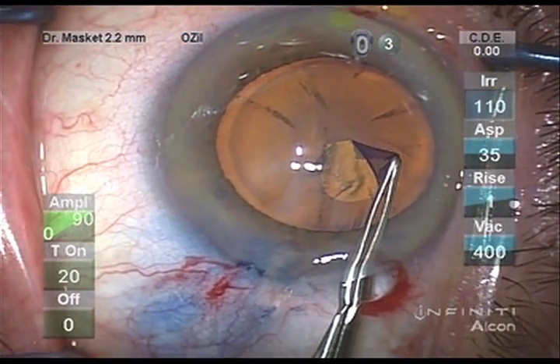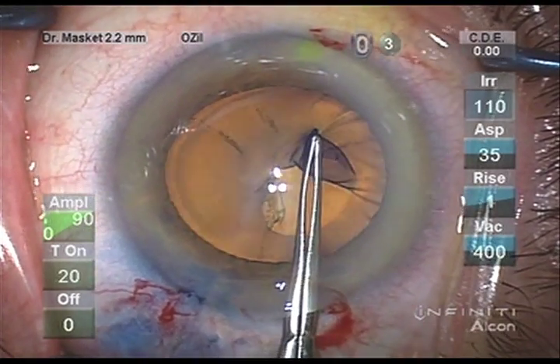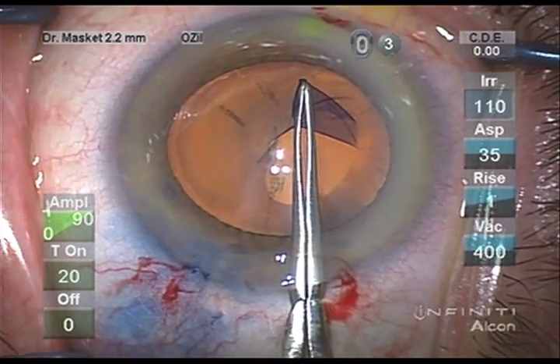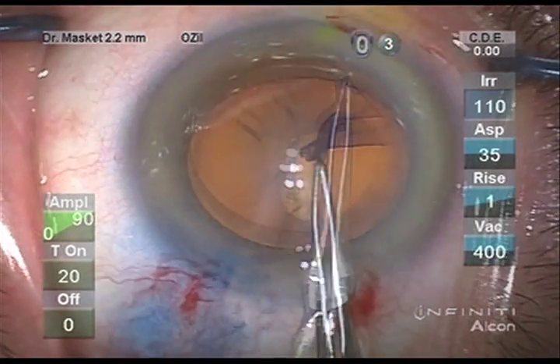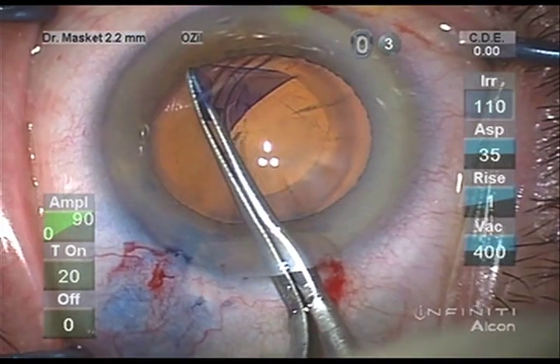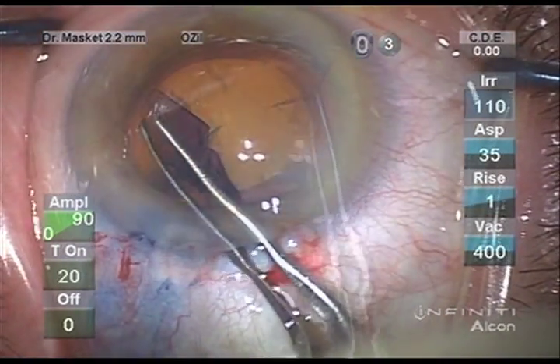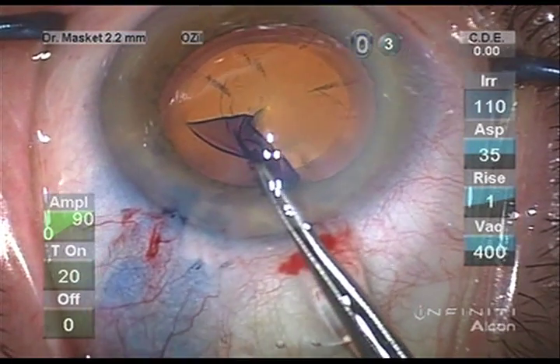Fortunately, I was able to create an adequately sized, placed, and centered anterior capsulotomy aided by the trypan blue. Multiple capsule folds, however, are noted as the capsulotomy proceeds, indicating the significant weakness of the zonules.